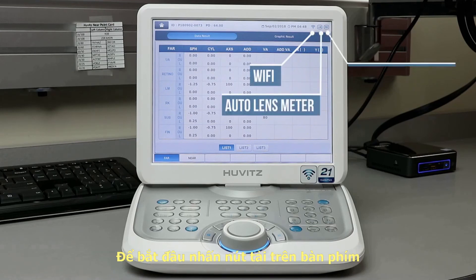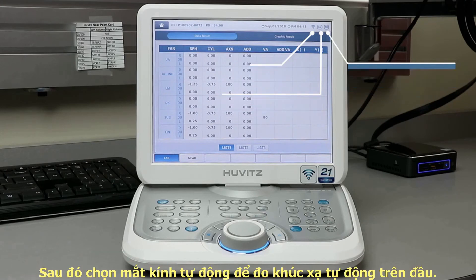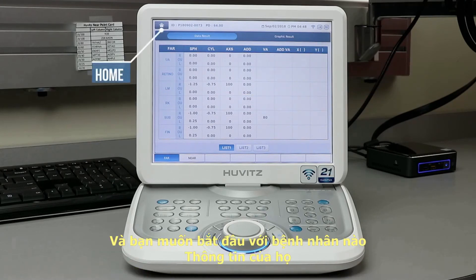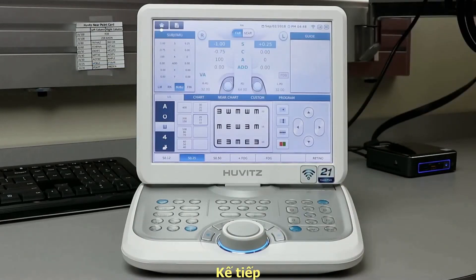In the top right corner, you will see the icons for Wi-Fi, auto lens meter, and auto refractor keratometer, showing that these are all connected. In the top left corner, press the home icon to go back to your main screen. On the keypad, press clear and you can start a new examination.